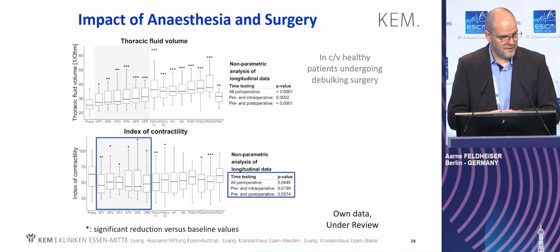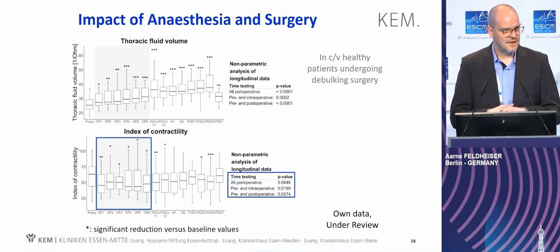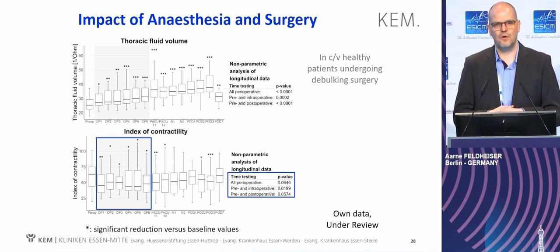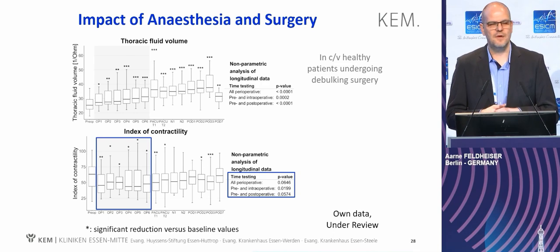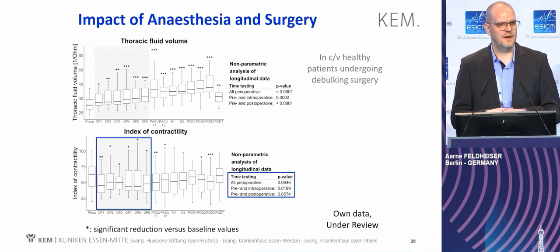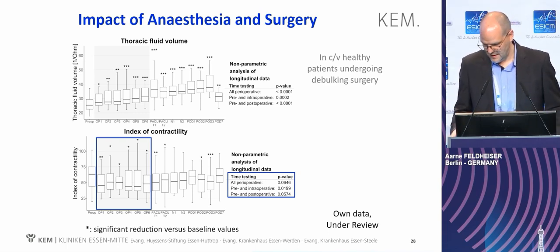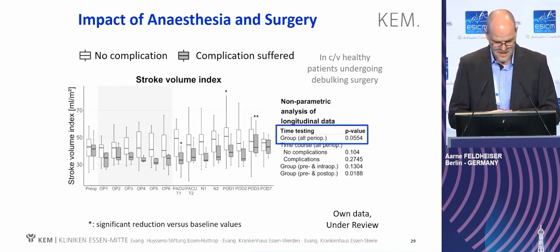And further interesting for me was that the index of contractility, as a contractile marker of the myocardium, was reduced throughout the whole surgery. And this is really interesting because these were very healthy patients. Yeah, they were cardiovascularly healthy. So it can be just by our anesthesia and just by our opening up the abdominal cavity.